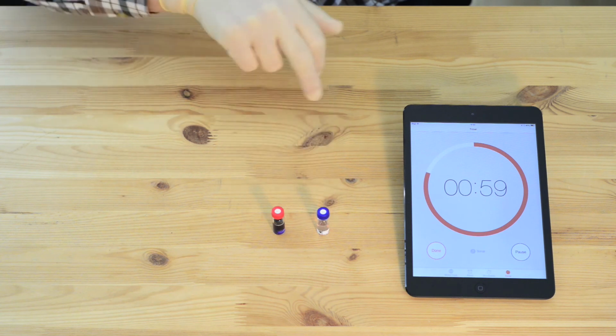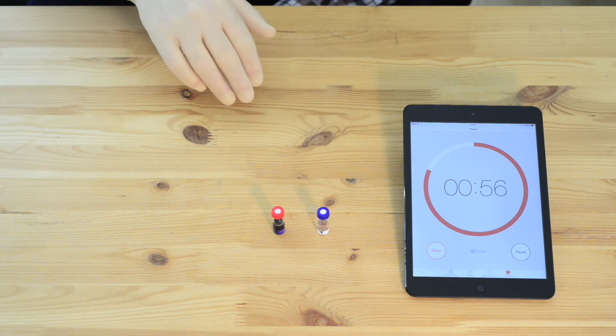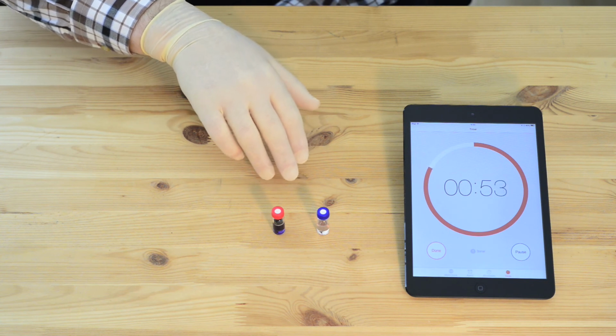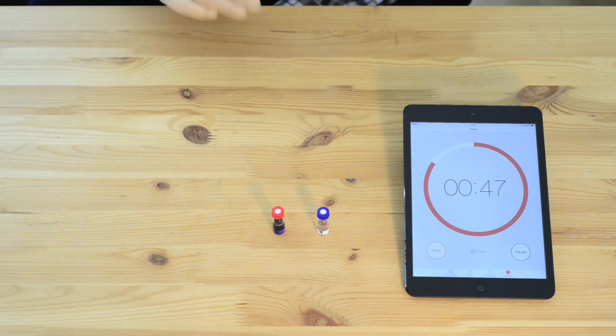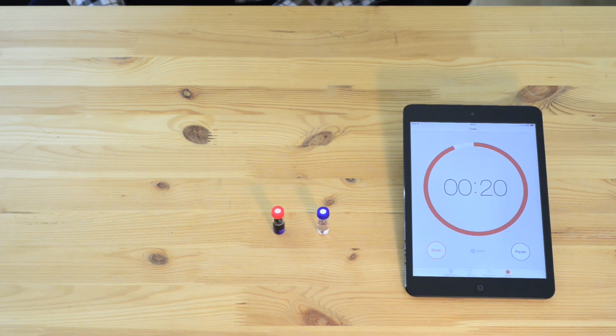The reason for a reference is really twofold. Yes, to show a cutoff at 20 milligrams per deciliter. However, it also takes care of any potential interference that may be in the patient sample itself. These could be propylene glycol, perhaps, which is contained in some animal foods, or sometimes hemolysis, the red blood cells will add a little color. So to eliminate any issue with a decision, the reference vial takes care of those issues.